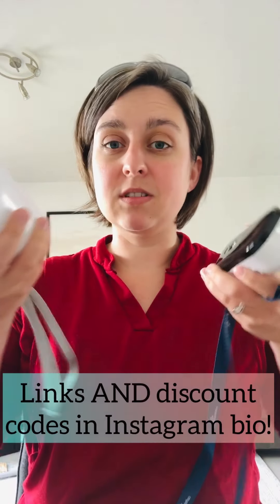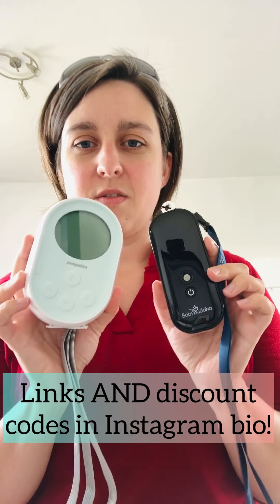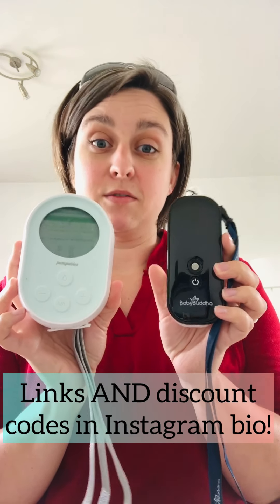This is the smaller one from Pumpables. First off, you can see an obvious size difference — the Baby Buddha is actually about twice the size of this one. It's also heavier, not by a lot, but what you'd expect.